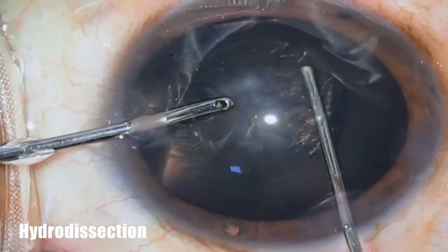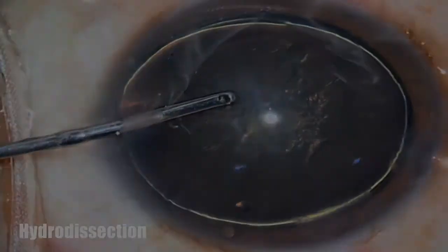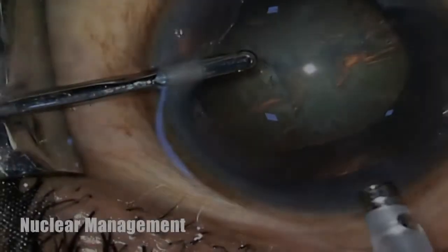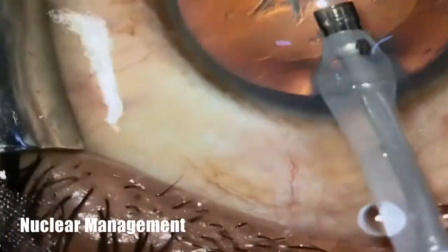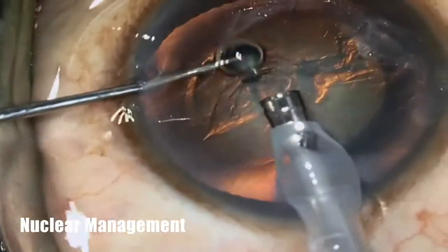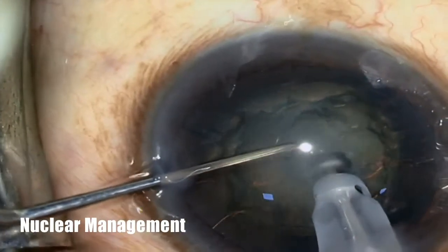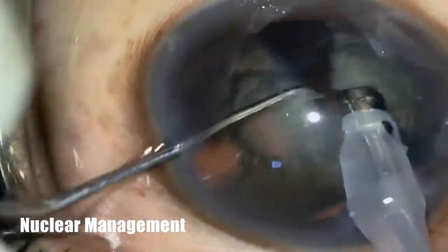Hydrodissection is performed routinely. During nucleus management, first insert the phaco probe with irrigation on, and later replace the chopper in the left hand. If phaco energy is used, direct chop technique was employed.